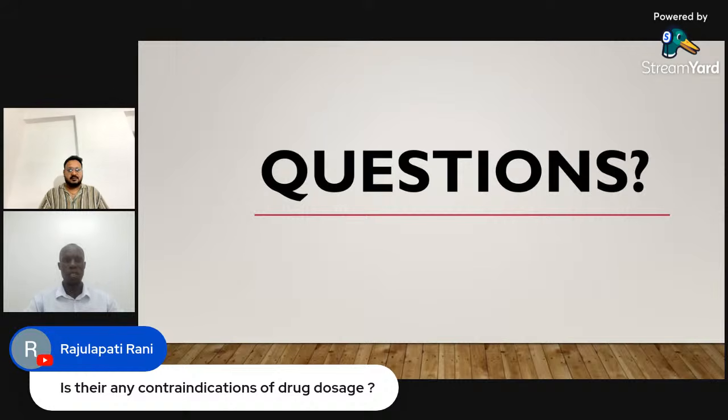Don't just give calcium to pediatrics; ensure you're doing the right dosage, and mostly when you're doing priming. Remember, when you prime, you need to add calcium because that blood doesn't have calcium. So give the right dosage. That can cause blunder. In pediatrics we should calculate the dosage very precisely. In adults, maybe we can give some extra dose, but in pediatrics it should be accurate.